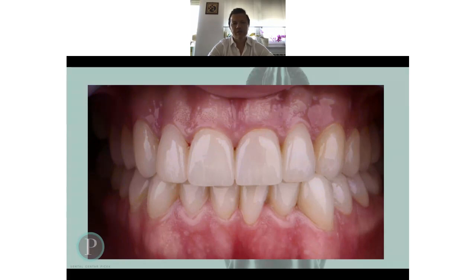It's also not easy to put in a 14, 15 by cords, and then after that they put impression material, take the impression, and you see on the, I don't know, 14 or 13 units are well impressed, and the one unit you had a problem with, of course, some saliva or blood came, and you don't have a sharp margin, and it's now of course a problem for the dental technician.